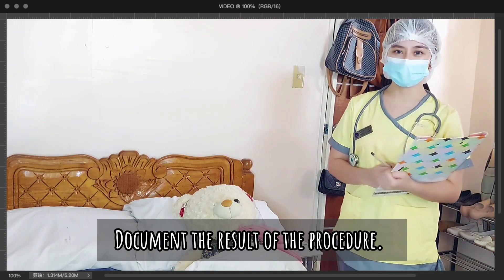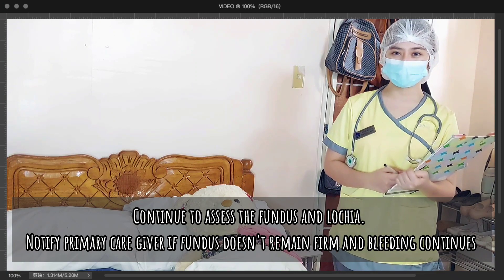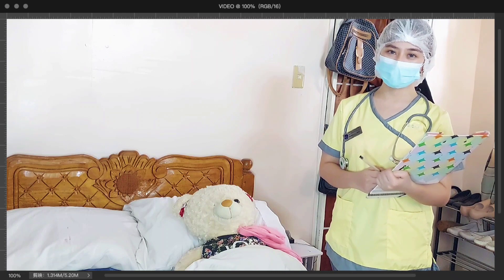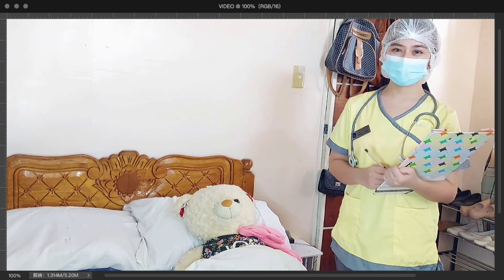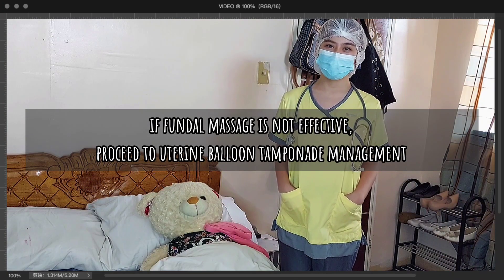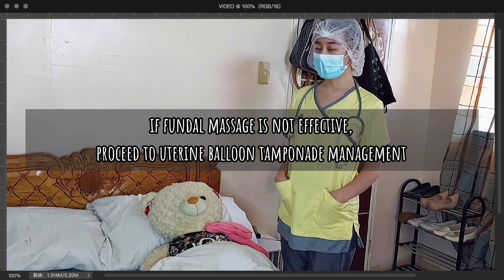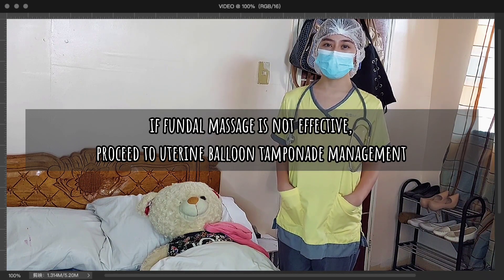After everything, I will document the result of the procedure and I will continue to assess the fundus and lochia of the patient. I will also notify the primary healthcare provider if the fundus does not remain firm and if the bleeding continues. And if it is not effective at all, I will now proceed to balloon tamponade.